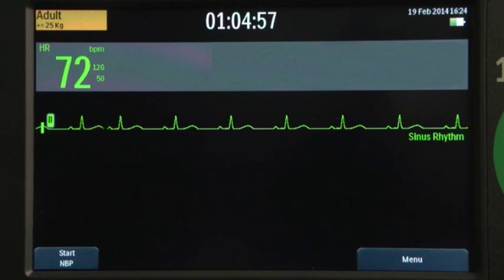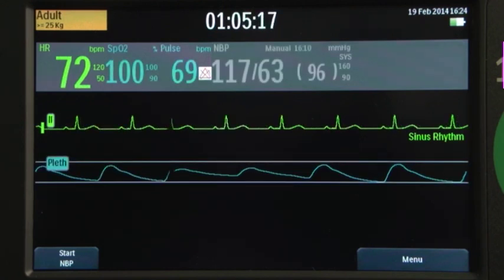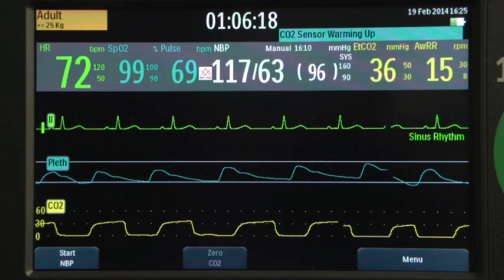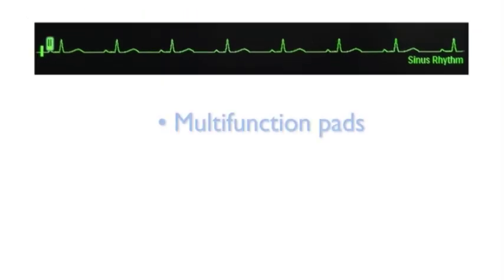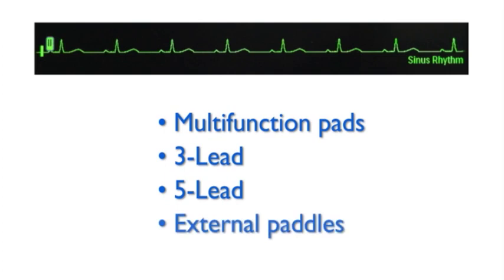With the Officia DFM100 you can monitor ECG, pulse oximetry, non-invasive blood pressure or NBP, and end-tidal carbon dioxide. When monitoring ECG you can use the multi-function defib electrode pads or monitoring electrodes attached to a three or five lead set. You can even use external paddles to do a quick assessment only.